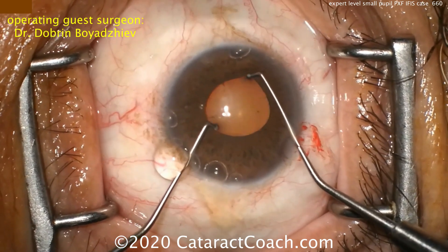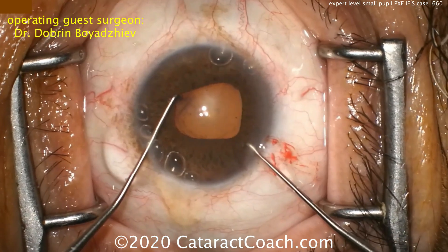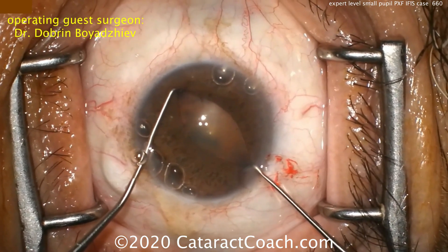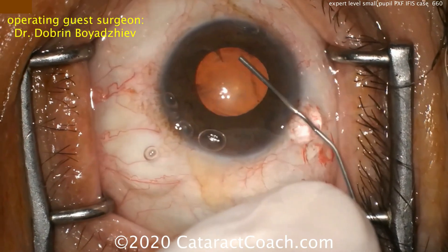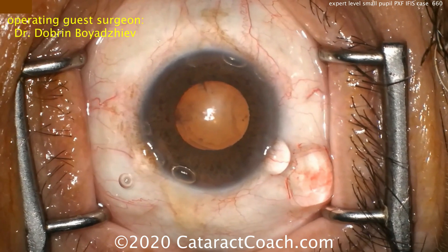The iris is going to be stretched out now. Pupil stretching using two choppers, carefully hooking the pupil margin of the iris — don't damage the lens capsule. Do it again about 90 degrees apart and pull the instruments way back to the angle. Now a little more viscoelastic, and now you've got about a four and a half millimeter pupil. That looks pretty good — that's going to make life pretty reasonable.